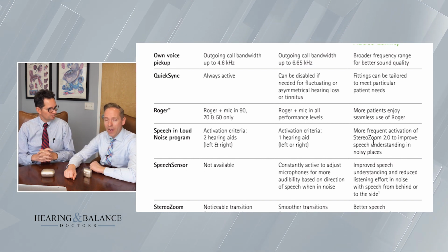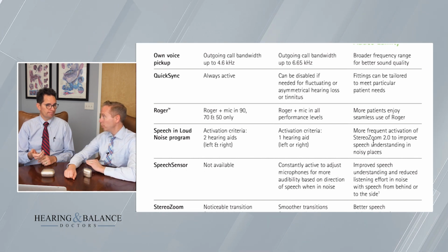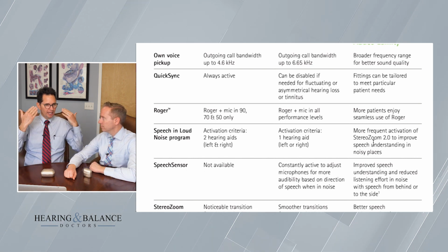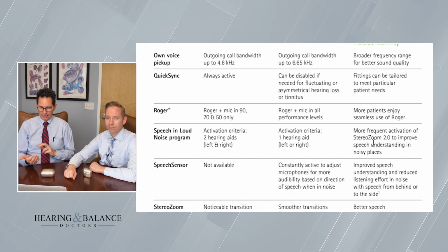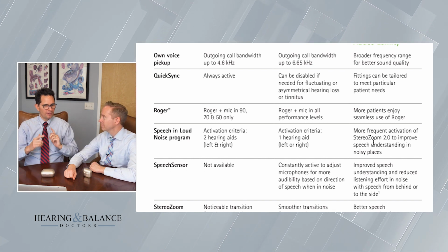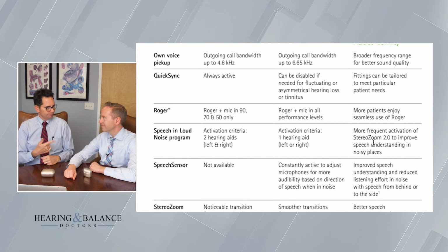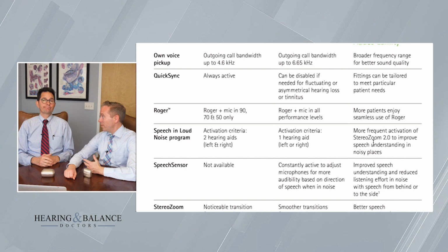I do too. I would say that if you're an Android user, Phonak is probably your best bet for the most consistent Bluetooth connection. Yeah, if you enjoy interfacing between your phone and your device, because not everyone does, but if that's important, like I want to take my phone calls through my hearing device, I want to stream audiobooks or music, Phonak is great. And both the Lumity and the Paradise do a good job of it.